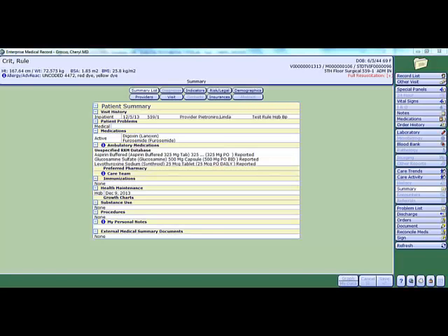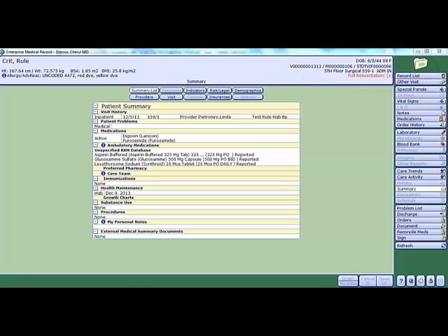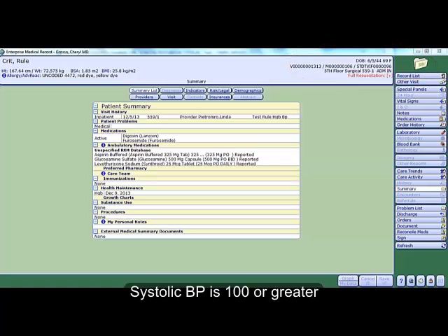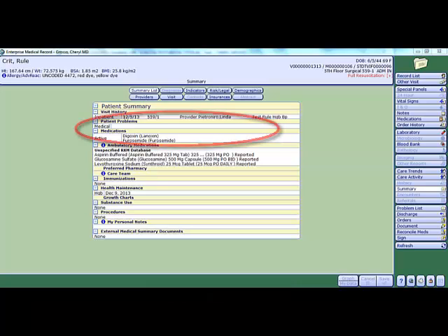In Meditech, when ordering the transfuse PRBC order, the provider will be alerted during order entry if the patient meets the following criteria: the patient is over 18 years old, the patient's systolic blood pressure is 100 or greater, the hemoglobin is 7 or greater, and the patient does not have an active patient problem of bleeding or other similar patient problem on the patient's problem list.